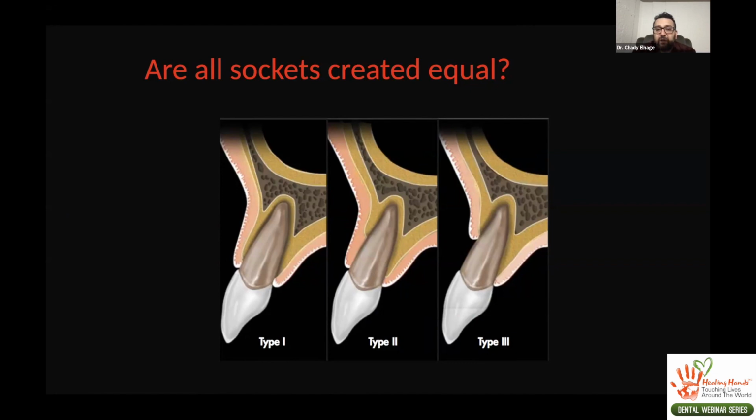It comes down a lot to your personal preference. Basically, when we look at a site in our practice, we always try to shoot for the most natural route. I'll give you an example. Sometimes there's some bone loss between teeth, and let's say you're going to take out some central incisors. By the time you remove the teeth, if you don't graft the sites and you place the implant, let's say you have 5, 6, or 7 millimeters of difference from the adjacent tooth's CEJ to where your implant platform is.